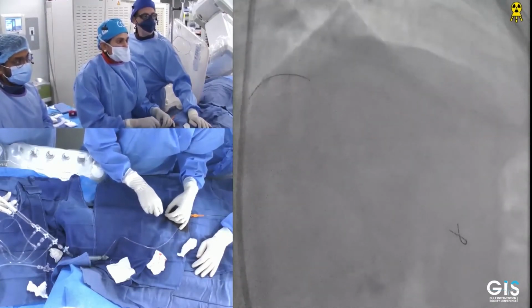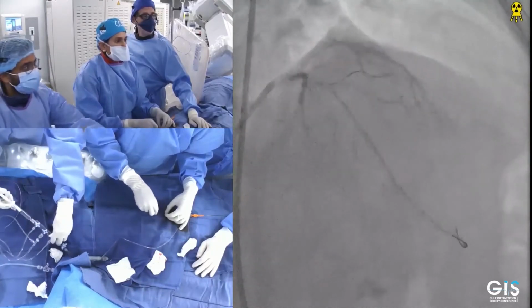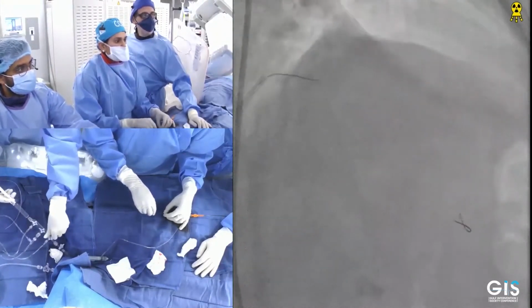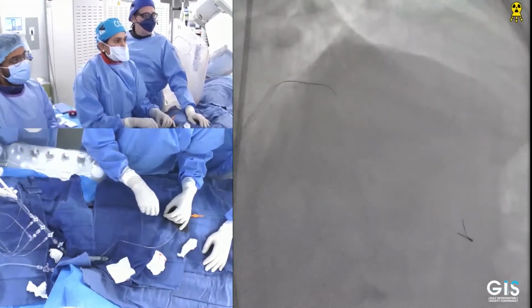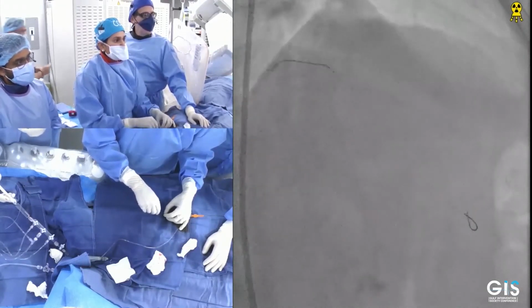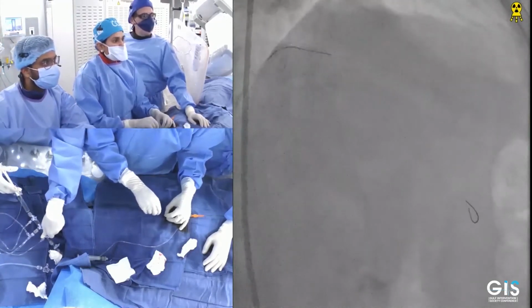A bit further. Okay, some die. Yeah, oops, that's a top branch. Okay. Taking the diagonal is a little tricky because you want to point upwards to enter it, but then point downwards to avoid that small branch. Otherwise, as we said in the beginning, there is no lesion, but a few millimeters after the ostium, there is a diagonal lesion.